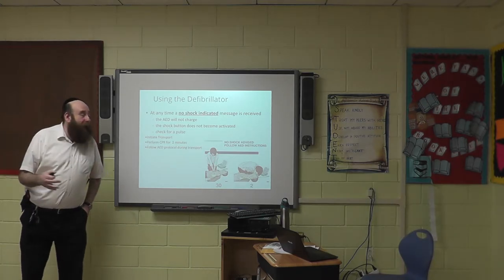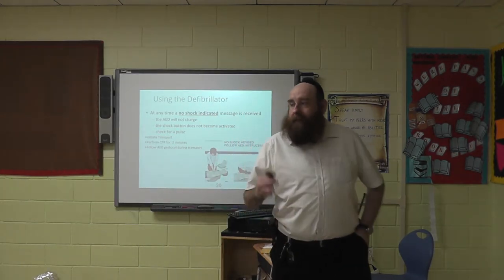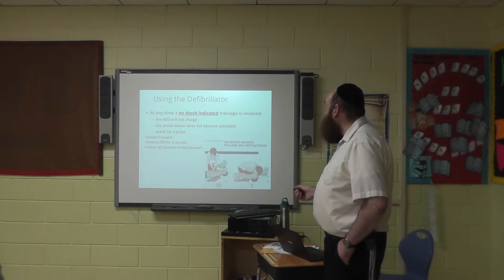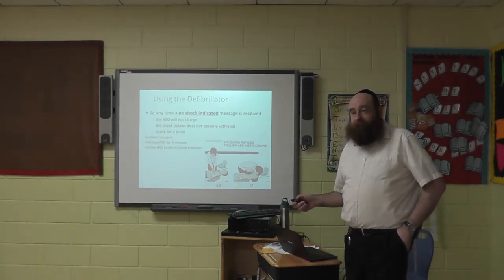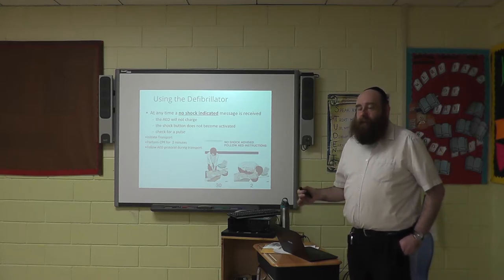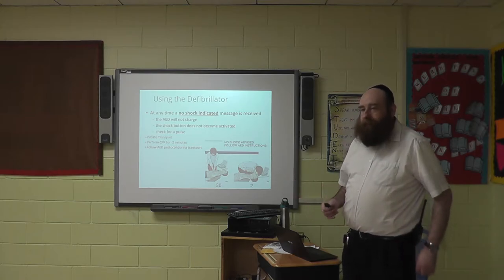All right, so, couple of things. Immediately after shocking a patient, you resume CPR compressions. Should we say that again? No, unless the patient wakes up. Immediately after defibrillation. Do you wait to defibrillate until you've done 30 compressions and then stop and then do it? Every 2 minutes. For the initial first one, use it as soon as the defibrillator gets it. So if you're in the middle of compression, stop? Stop, do it. And then start from the beginning.